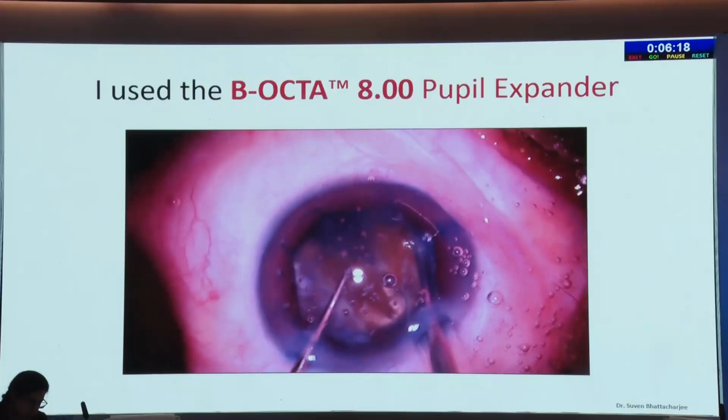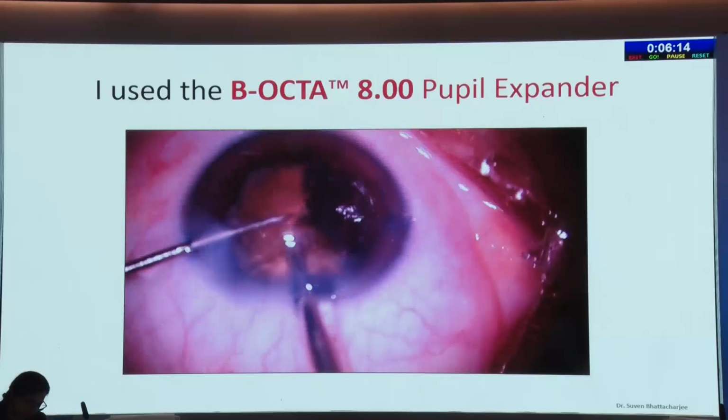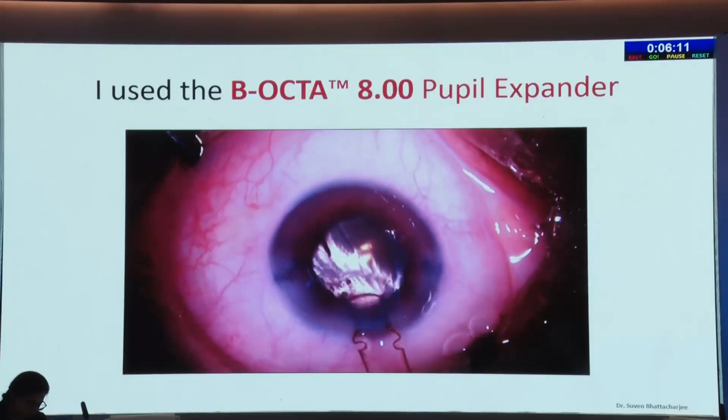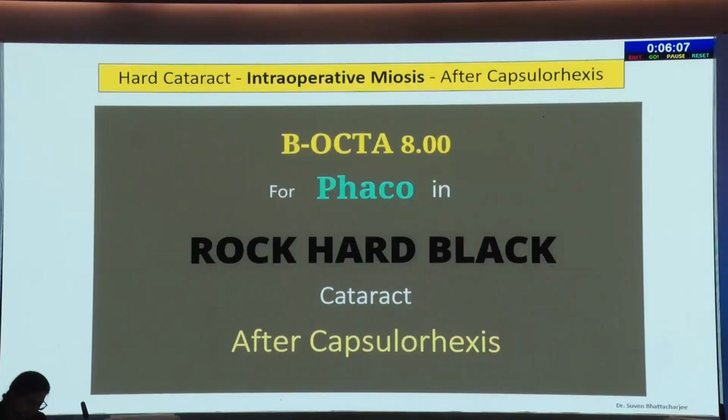And now this is a thick, leathery cataract over there. And I'm so happy that I have such a wide pupil to see and safely do the surgery. Rest of the surgery was okay. So now this is another scenario.